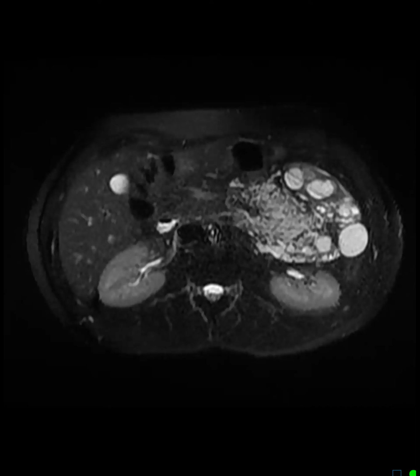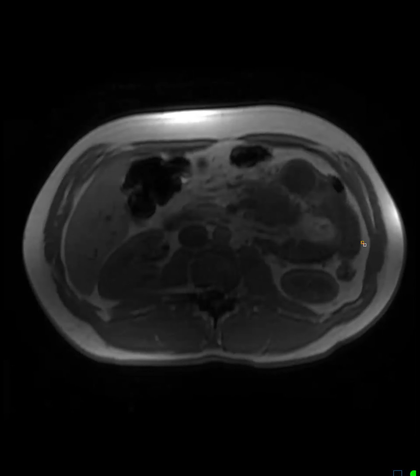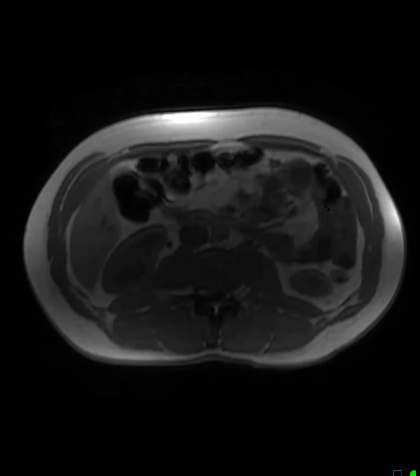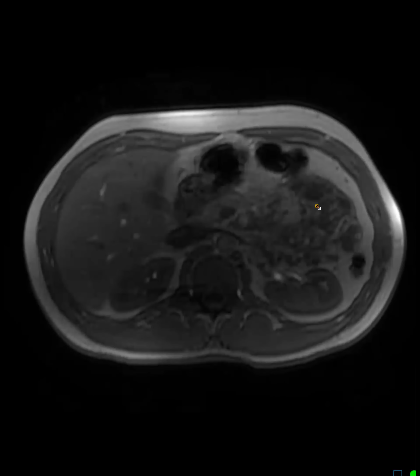Oh, sure. I do feel like that lateral part looks more inflamed, but I agree that it's a really cool case. So our T1, not that good, but we don't see any obvious T1 bright areas. And it's pretty weird. When I was reading one of the case reports, they said this could be asymptomatic, but also could result in GI bleeding and even protein-losing enteropathy. But obviously what was interesting was that this could lead to GI bleed.